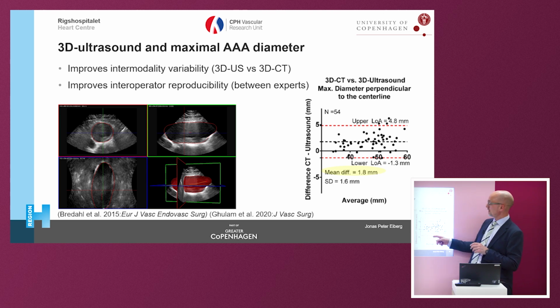And this 3D CT, that's a reconstructed CT. It's not the usual CT that you normally look at where you just scroll over the screen. So this is a modality that is much better than what most consider is the standard.